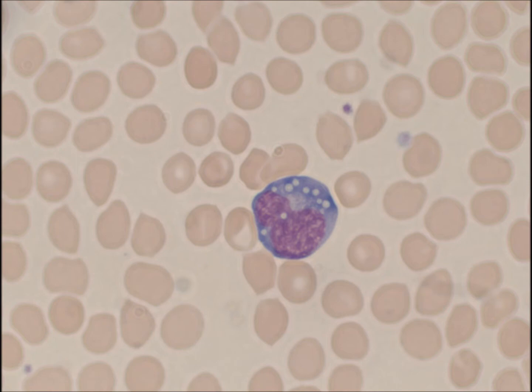What we're going to look at in this video are three major components when looking at a Giemsa stain. Those components are, first, color, followed by shape, followed by location. These three will help guide us in reading what's going on in the blood.